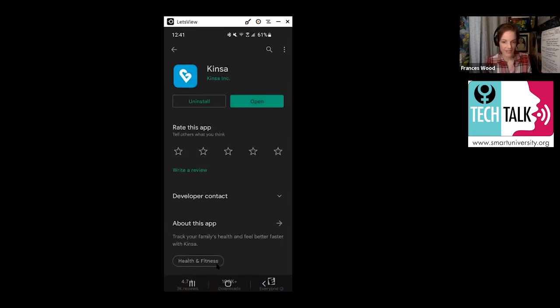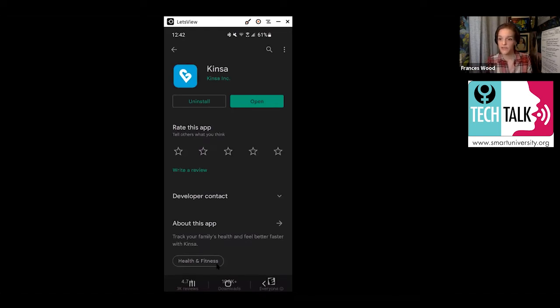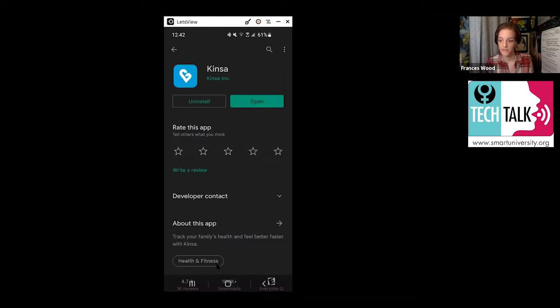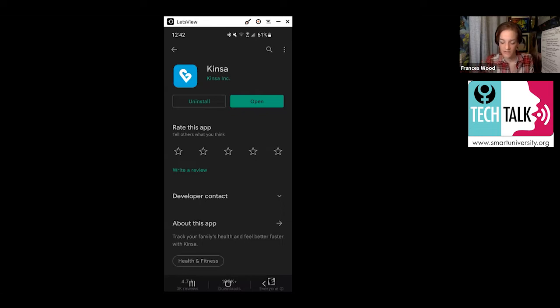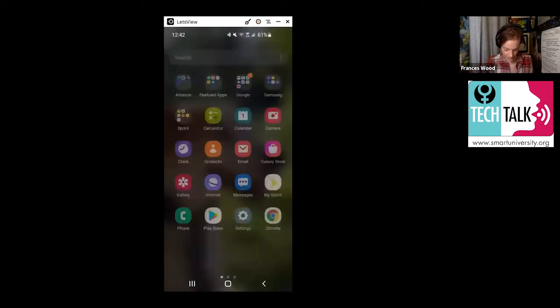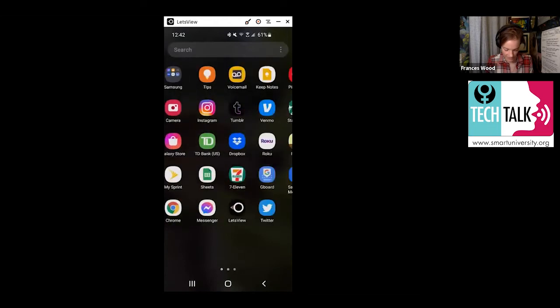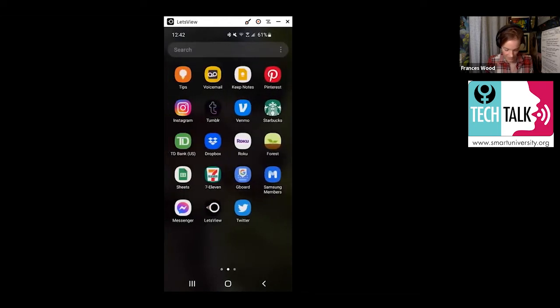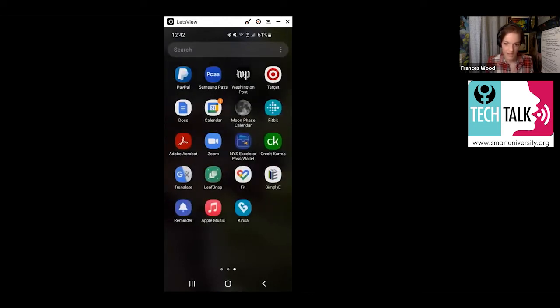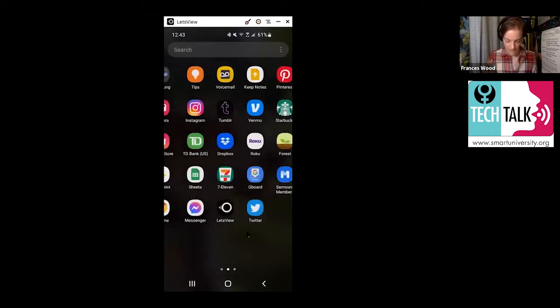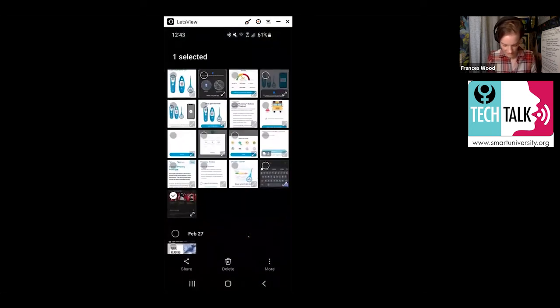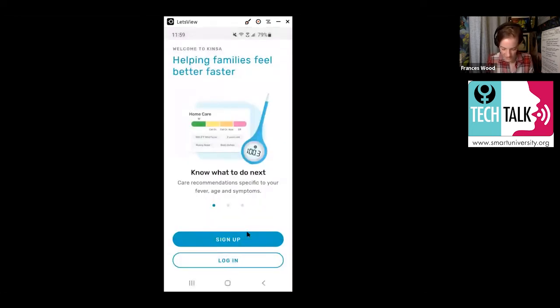If you've got that, you're going to hit install. You'll see that mine says just open because it's already installed on my phone. But you should see the button that says install. So once you have it installed, you're going to either click this button here that says open or you're going to find it on your phone. It looks like this right here, this little heart at the bottom that says Kinsa.